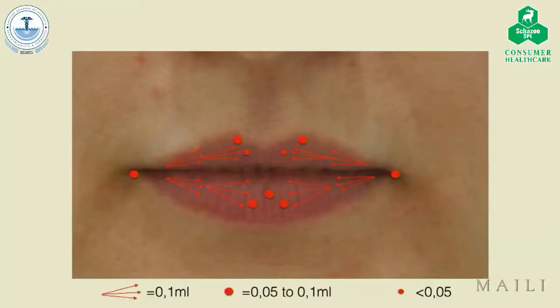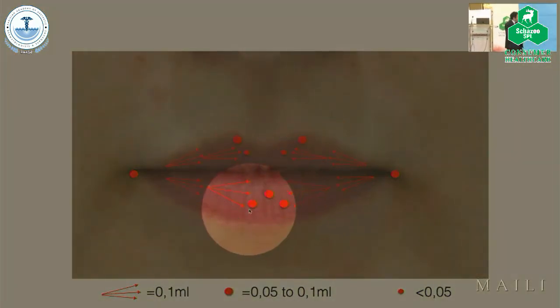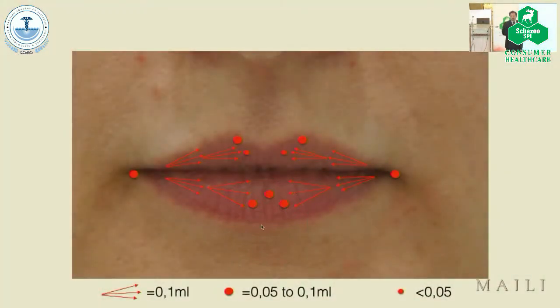And how we do lips? Well, everybody has different ways of doing lips. This is a way of how most of the time I do my patients, by doing the injections with the needle in the mucosa, some small bolus somewhere, and the quantities vary. They don't need to be the same. But again, it depends on the structure.